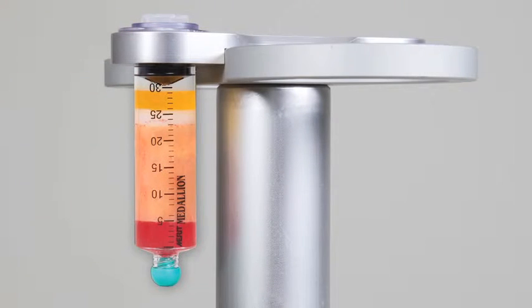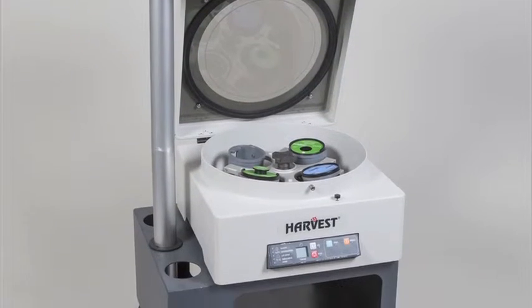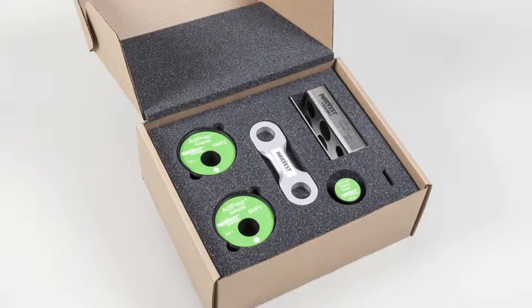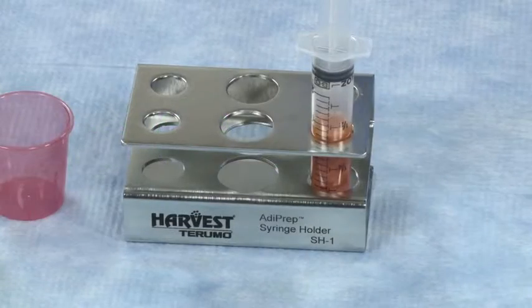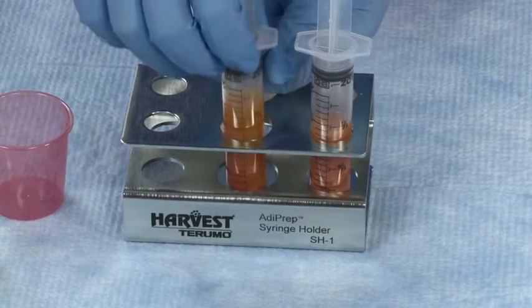The materials required for isolation of concentrated adipose tissue from a sample of lipoaspirate are a microprocessor-controlled SmartPrep centrifuge system and an Adiprep centrifuge adapter kit. This kit contains centrifuge adapters and a balance weight to enable processing of the Adiprep process disposable in the SmartPrep system. A convenient syringe stand, designed for use during Adiprep processing, is included.